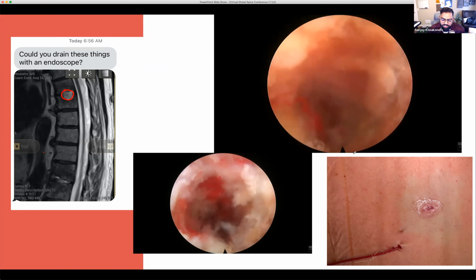It's an easier picture when you're having a higher, obviously more pressurized fluid, but clearly, as suggested by the question, there can be some issues with that. But there's pressure and flow regulation in most of the irrigation systems. Now for the endoscope, I usually have my setting at 30 to 40. I don't really raise it that much.